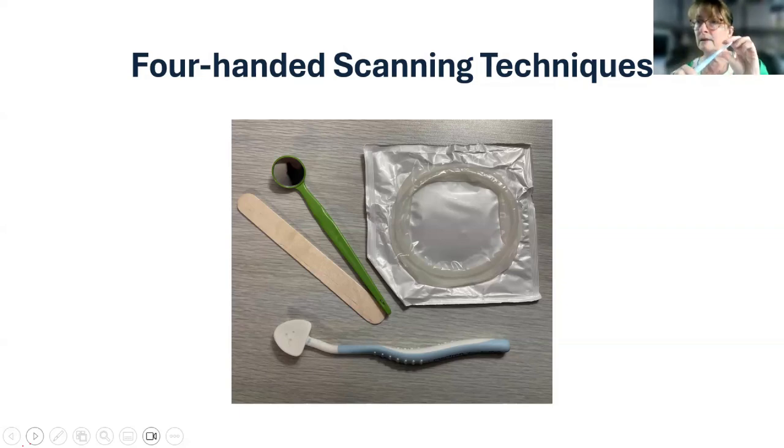It comes in the baby blue as well as black, which is really nice for scanning because it's completely anti-reflective, or a plastic mirror. Plastic mirrors, if you have them in the practice, work really well. What we want to avoid are metal cheek retractors. They're typically really horrible with scanners. The light reflection off the metal can cause issues, to say the least.